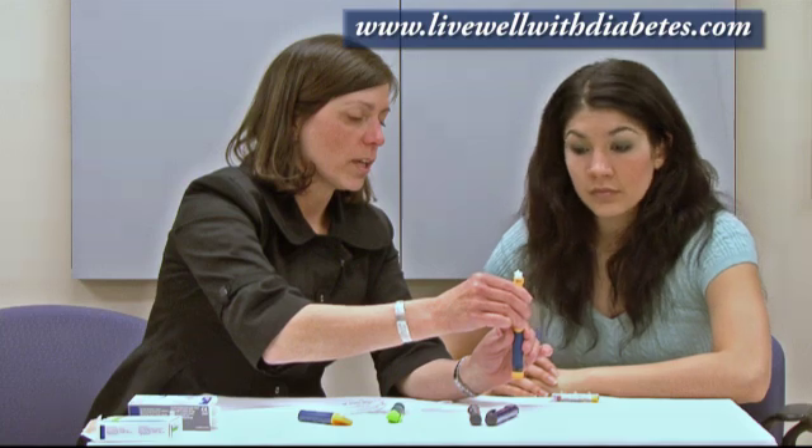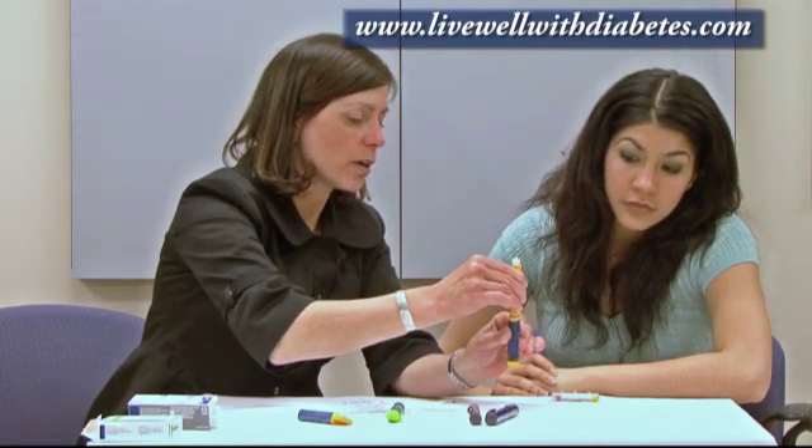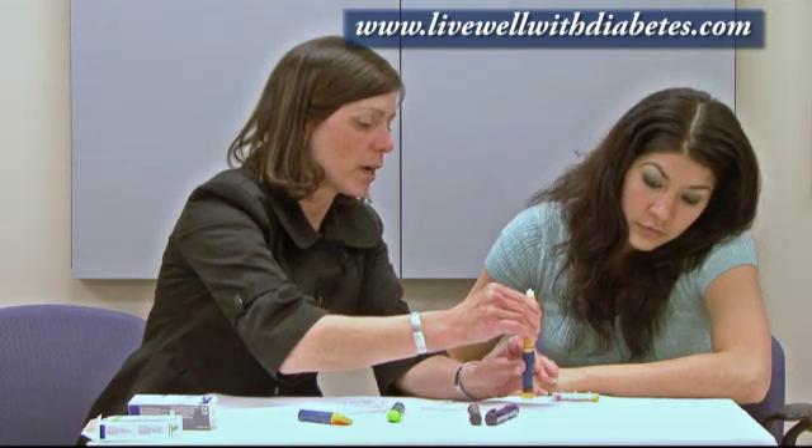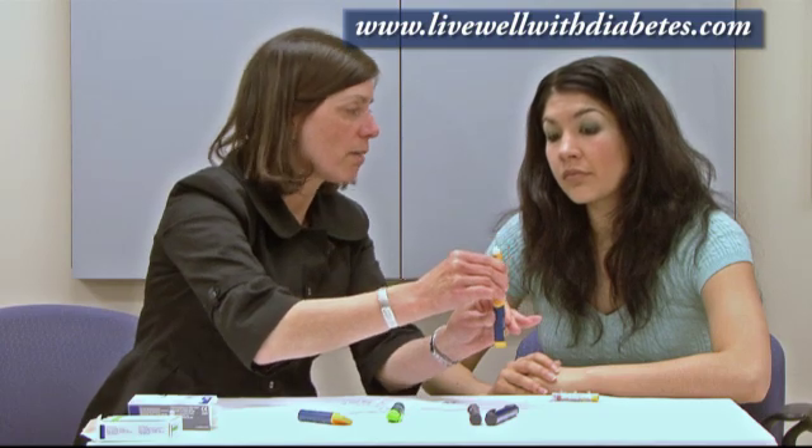Hold one hand on the yellow side, one hand on the blue side. Pull the two pieces apart. Simultaneously, push the button against the table. The dose window will go to zero, and now let go.